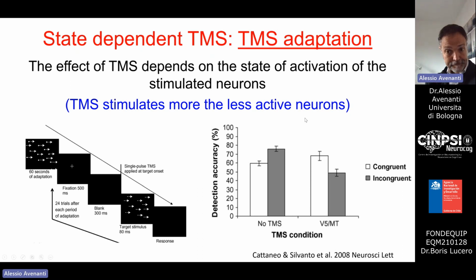So is that clear? So here you will see the performance. So this is the physiological response. The participants tend to show this performance when presented with the adaptation stimuli. This adaptation paradigm is basically the reverse of the priming paradigm, where typically you observe a facilitation.